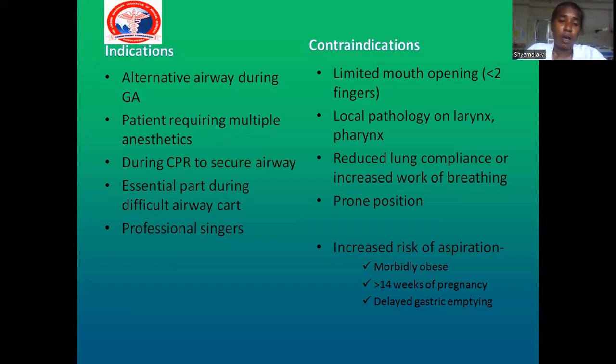perforation or intestinal obstruction, in whom they will have delayed gastric emptying, we can't take the patient under a supraglottic airway device.